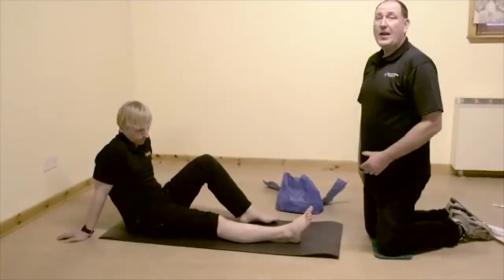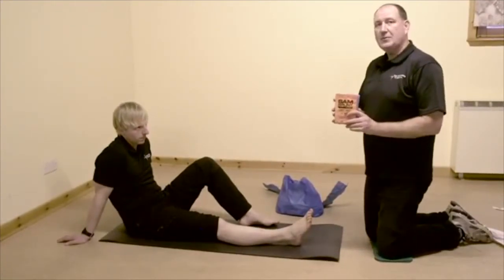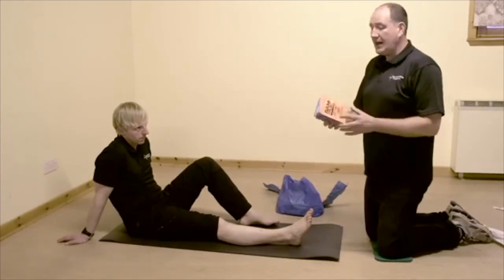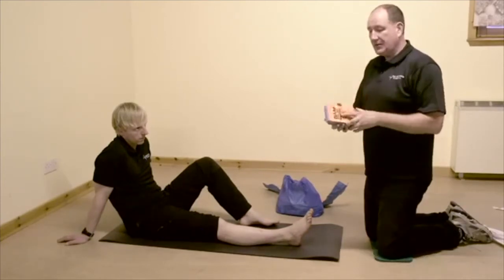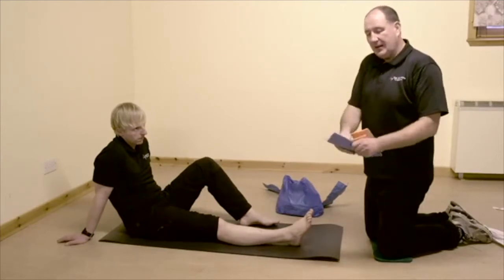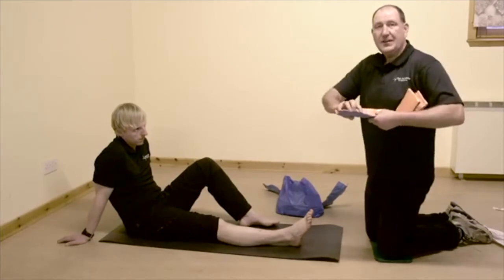For our next demonstration of how we could stabilize this leg, we have got a Sam splint. This is something some people might have come across before. These are very light to carry - it's a very thin aluminium with a little foam packing around it and is very flexible, slips in the back of rucksacks. But this Sam splint, once it is bent into a U-shape, becomes very strong and very stable.